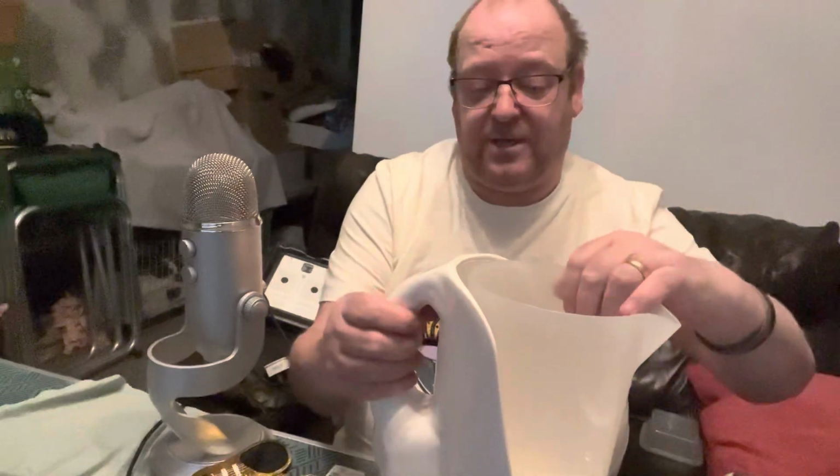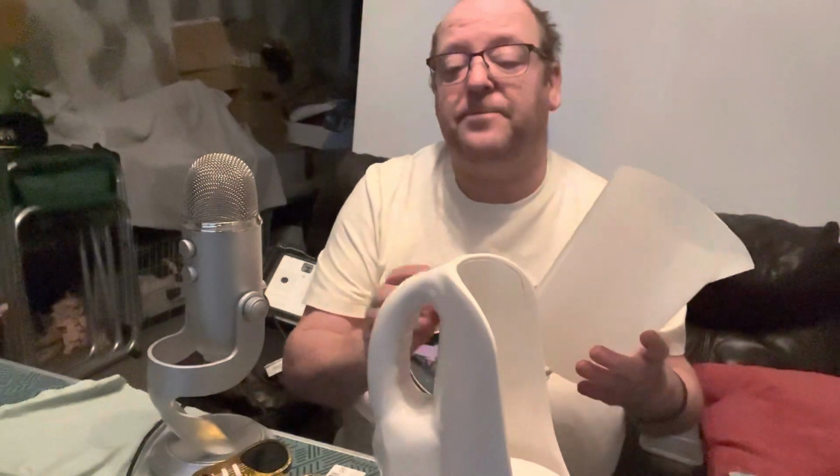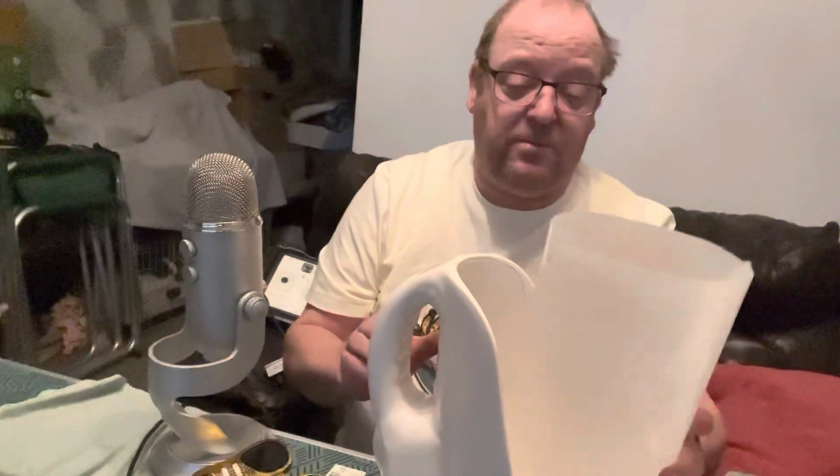Next, I have, as I mentioned before, a measuring jug, and this is instead of correcting your vision, this is helping you to live with that correction. So the jug actually talks to you. You can remove the jug so it's easy to clean, because you don't want to get the mechanism into the water. And how it works, the more you put in, you press whether you want it for dry ingredients or liquid, and it will actually tell you how much is in there.